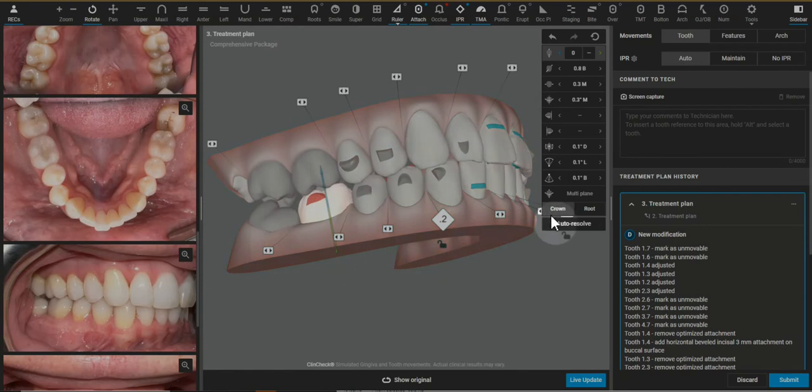I want to go ahead and make these first upper molars unmovable as well. And if you want to upright the lower molar, what I would prefer to do instead — I'm reducing this buccal movement, this translation movement.